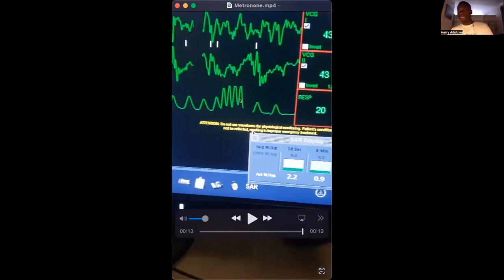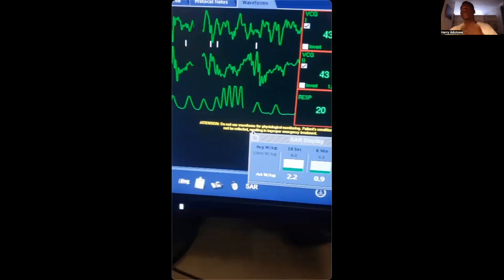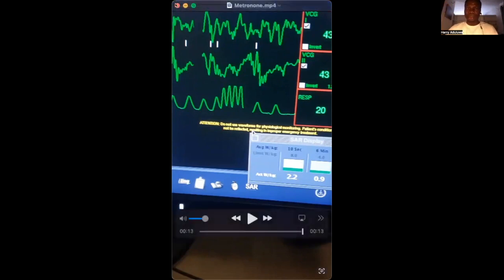So the first minute the patient breathes normally. The next 2 minutes the patient goes on hyperventilation, and then the last minute, which makes it 4 minutes, the patient breathes in, breathes out, and then holds their breath for at least 40 seconds. That 40 seconds tells us how long the patient can hold their breath. Then we can assess the images from normal breathing to hyperventilation breathing to the free non-breathing stage. You run a motion correction on the image and then send it to the radiologist.